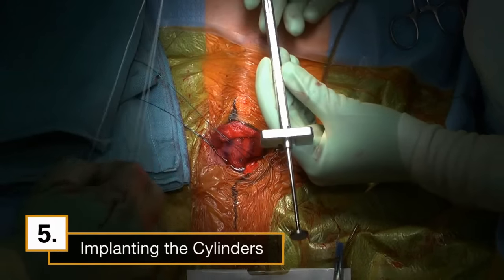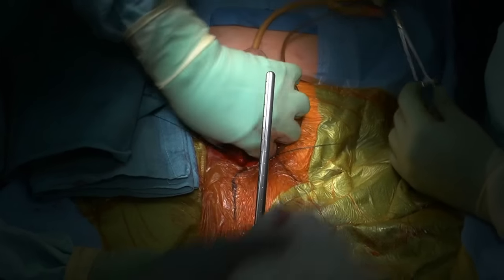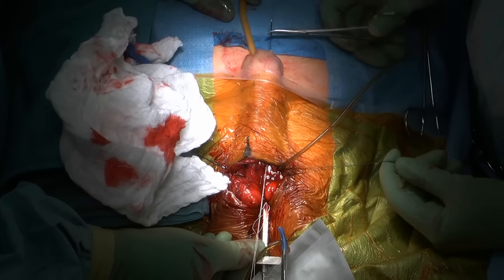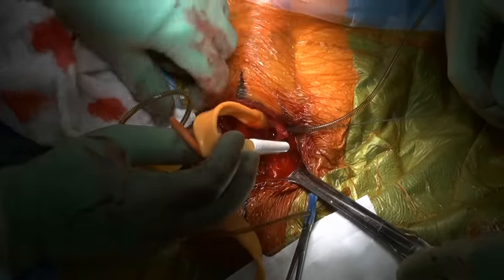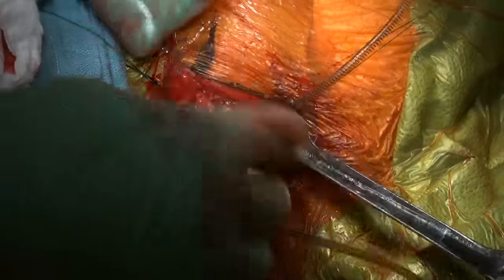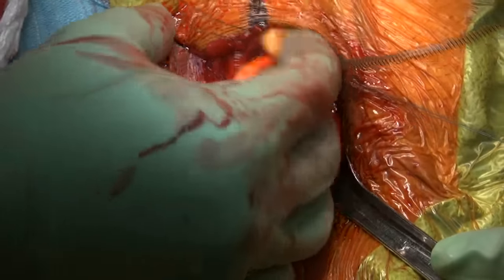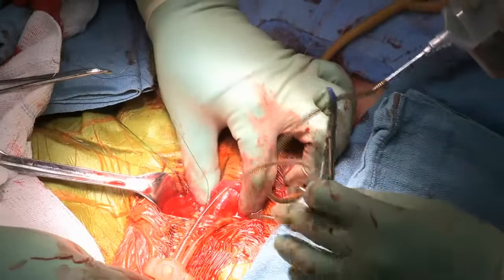We are now ready to insert the cylinders. We use the furlough insertion tool and the keith needle to help introduce the cylinders into the corpora cavernosa. Once the keith needle is passed, the rear of the implant is placed in the proximal corpora cavernosa. I insert the tip of the cylinder into the corporotomy and gently push the cylinder distally into place. We repeat this procedure and insert the remaining cylinder into the other corporal body. I'll gently occlude the corporotomies and we'll begin our surrogate reservoir test.